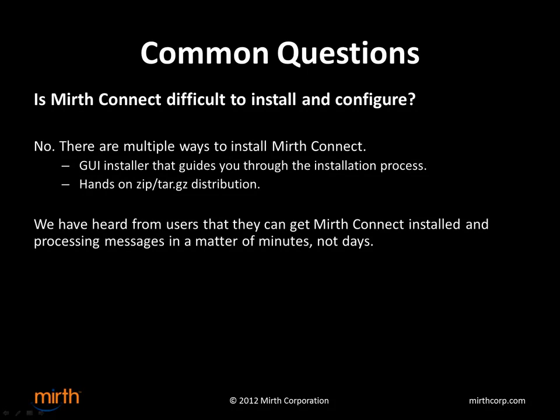Many different ways to install Mirth Connect. You could use a GUI installer that guides you through the installation, step by step. If you want more hands-on approach, you could download a zip or a tar.gz distribution, extract it yourself. We've also heard from users that they can get Mirth Connect installed and processing messages in a matter of minutes. So often people say, oh, you need some days to configure interfaces, read from HL7, pull out fields, write to a database. You can do that in minutes, even if you haven't used Mirth Connect before.